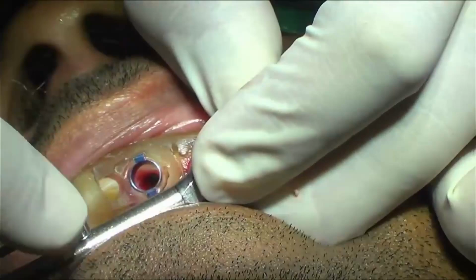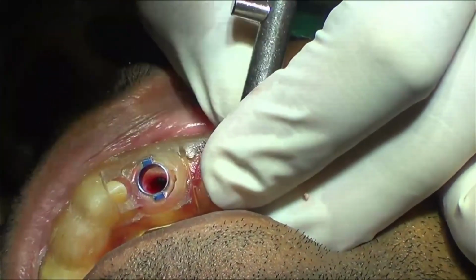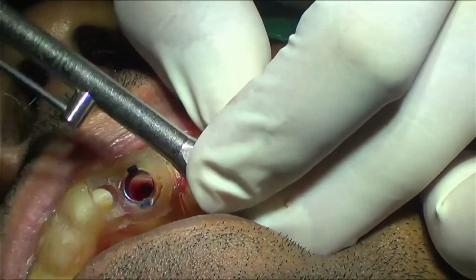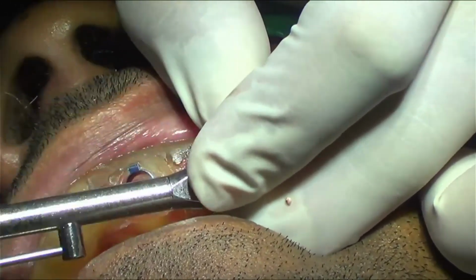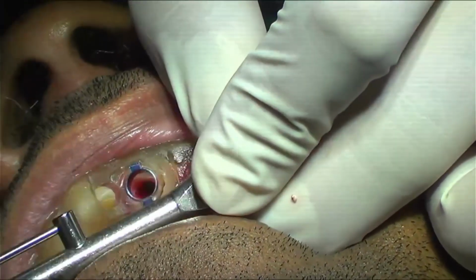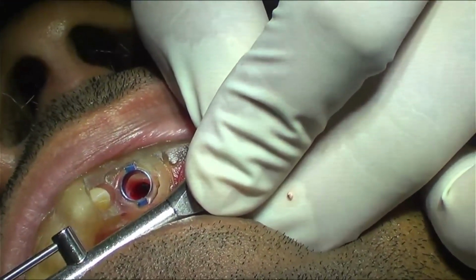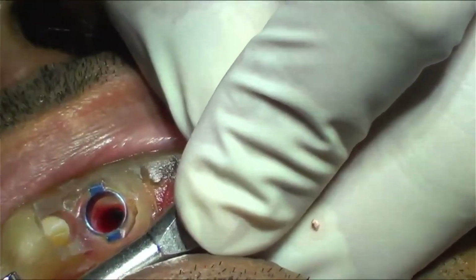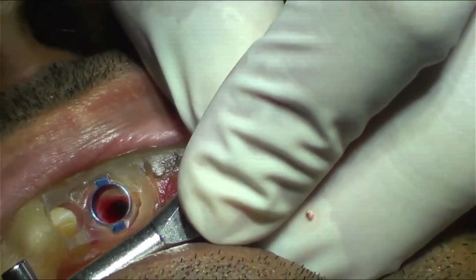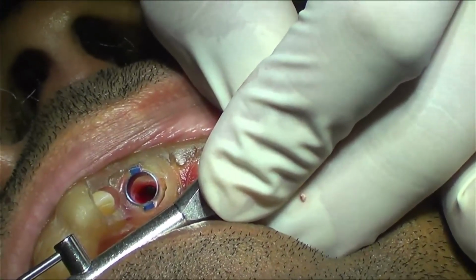We're reaching a torque of 50 Ncm. So again we will decompress. 1, 2, 3. Again wait. Waiting can be boring, okay? But only the boring is successful.